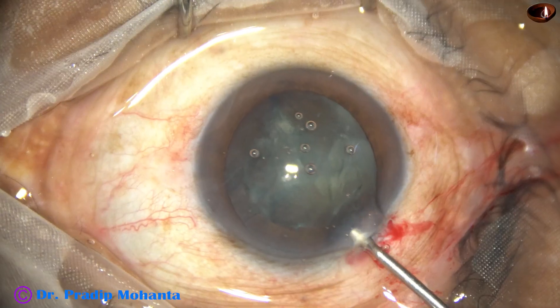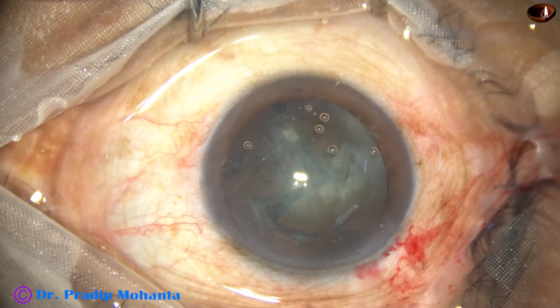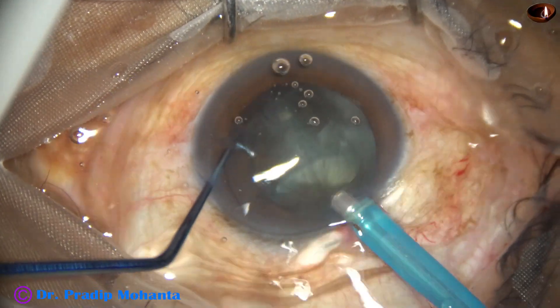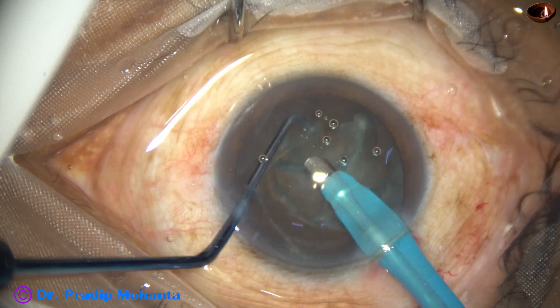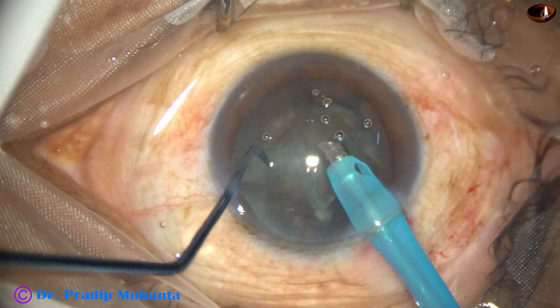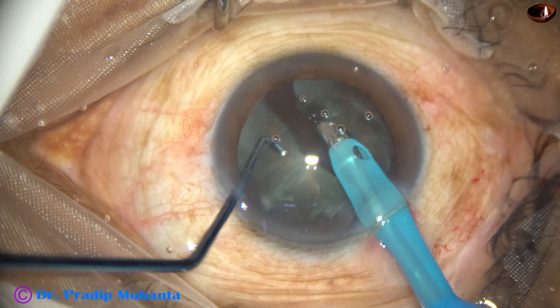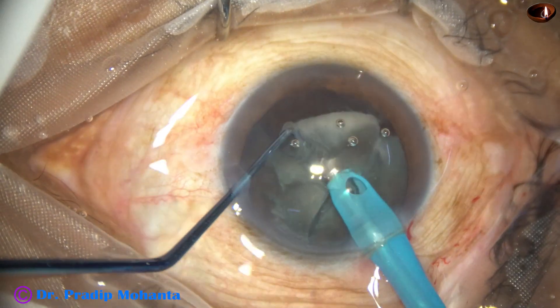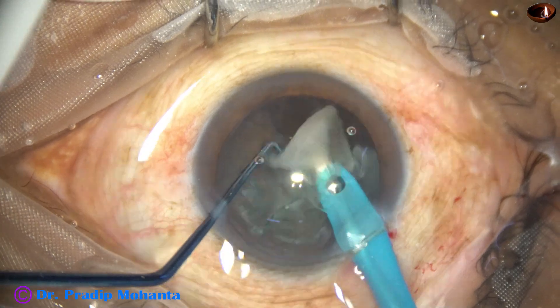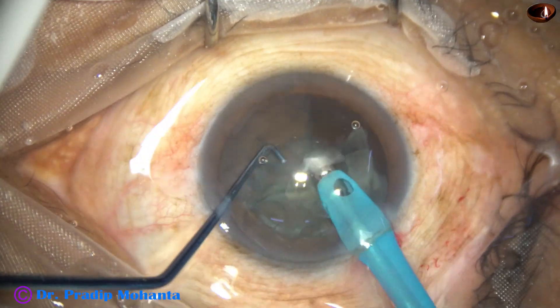Now the anterior chamber is filled up with visco again and the phaco needle goes in. The superficial cortical lens matter is removed. The pieces are separated from each other and picked off and emulsified.